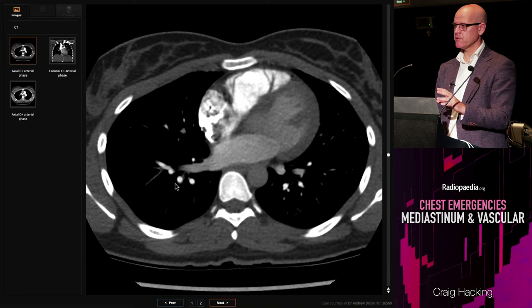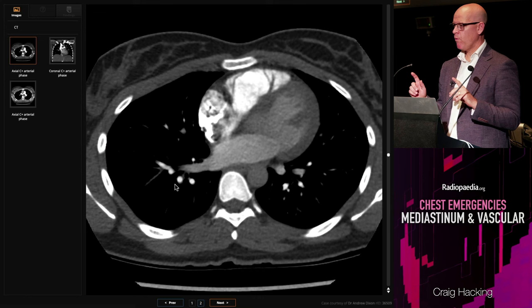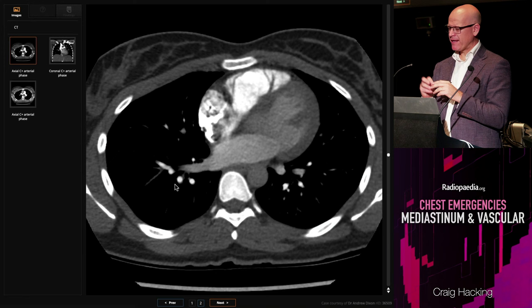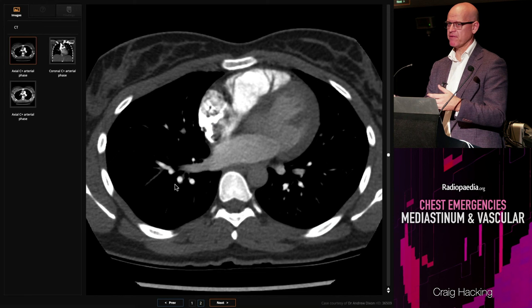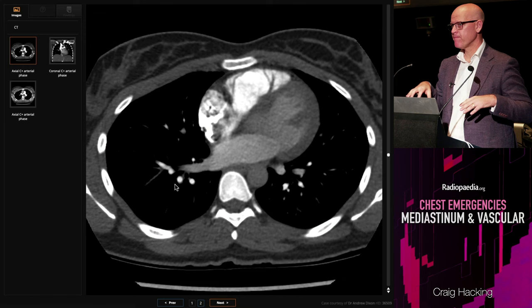This is a nice case because it shows you a couple of important things to remember about PE. One is 90% of them are multifocal. If you find one little sub-segmental one, keep looking — look for another one, because nine times out of ten there should be one. And there's a second one. Now I'm definitely confident that was a filling defect.